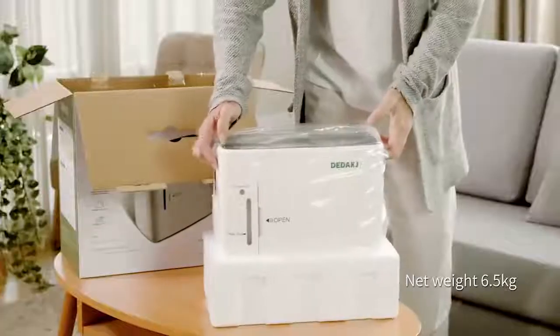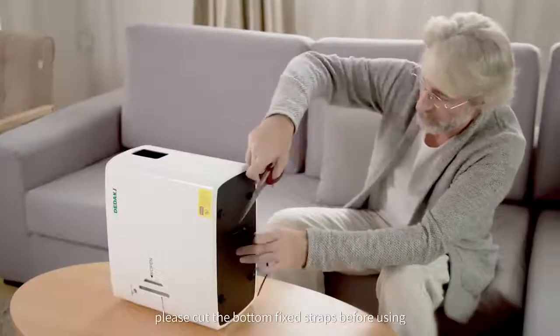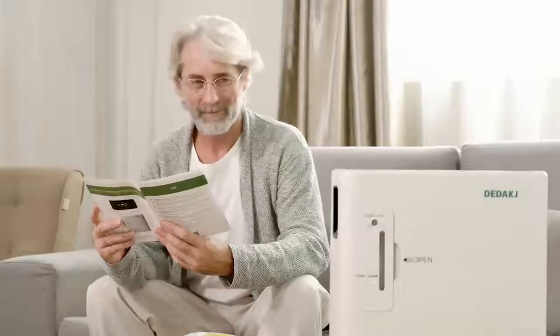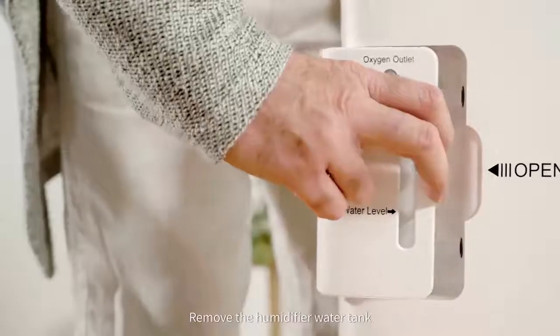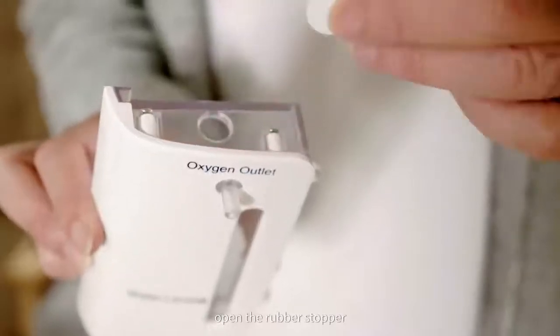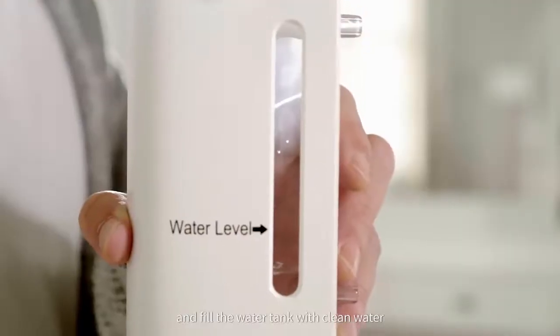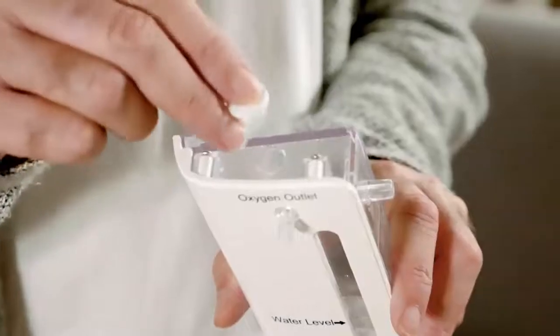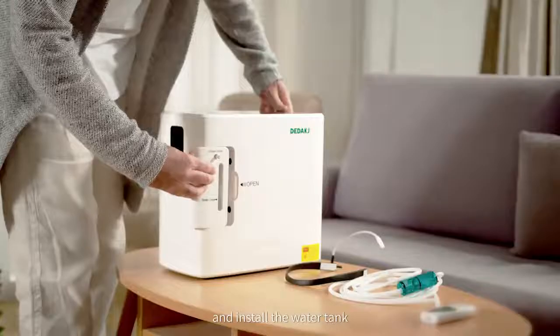Please cut the bottom fixed straps before using. Remove the humidifier water tank, open the rubber stopper, and fill the water tank with clean water, not exceeding the highest water level. Plug the rubber stopper and install the water tank.